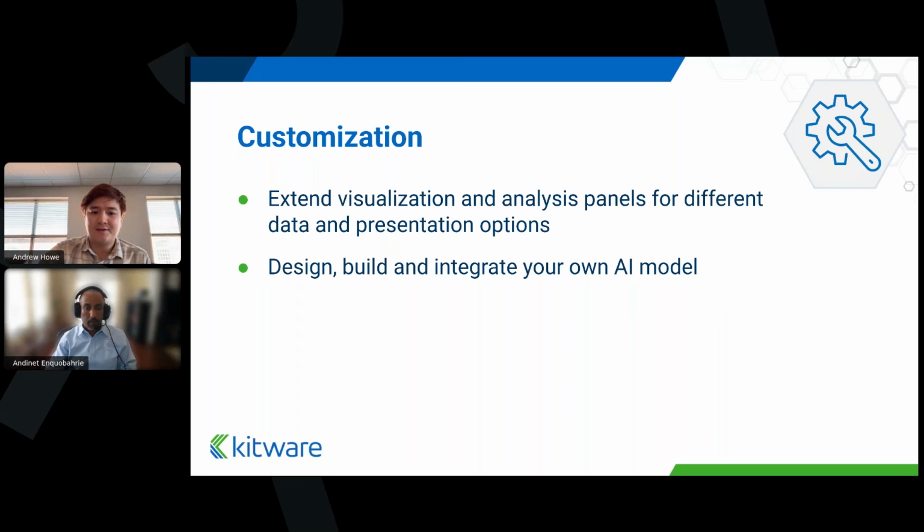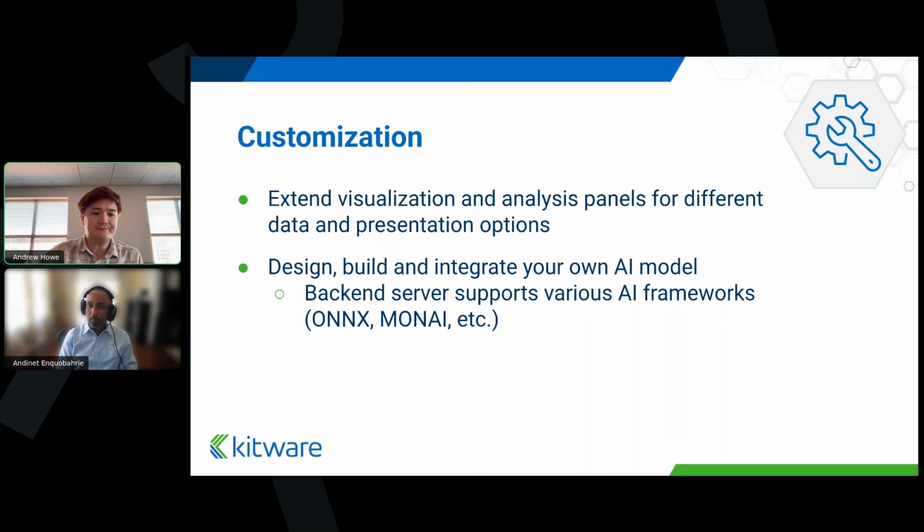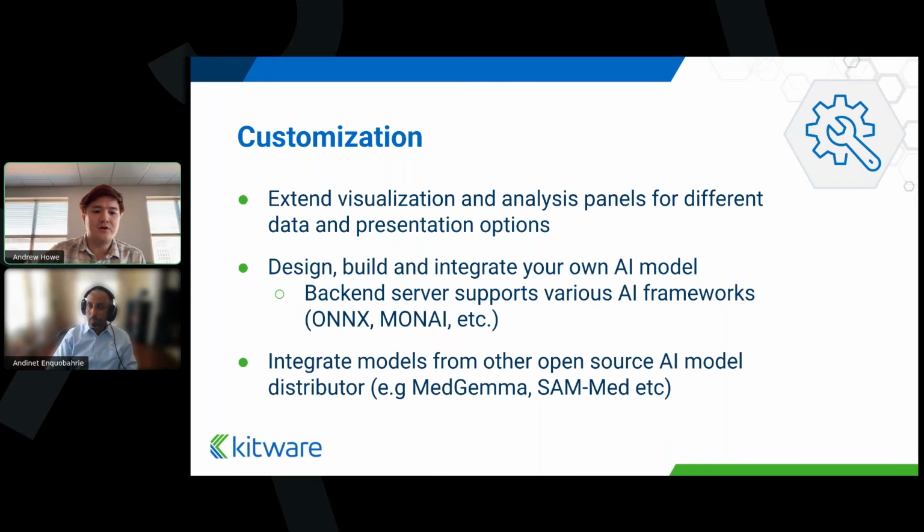Another thing is, if you've already trained AI models such as segmentation networks, classifiers, detection models, or even your own multimodal models, you can drop them into the service layer that we showed. And so that's what we've done. You can also customize workflows. If your team needs a specialized segmentation review tool, or a structured reporting pipeline, or a research-specific UI tab, those can be added. This is really important for institutions building internal AI ecosystems, or companies developing imaging products. So you can start with VolView as your foundation, then build up from there: your models, your logic, your branding, or your workflow.